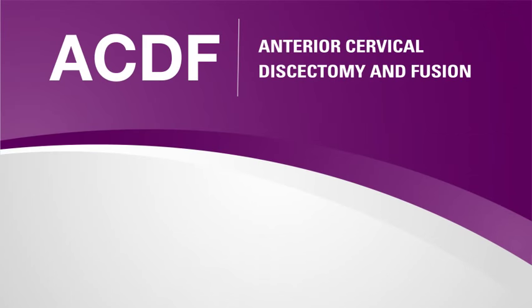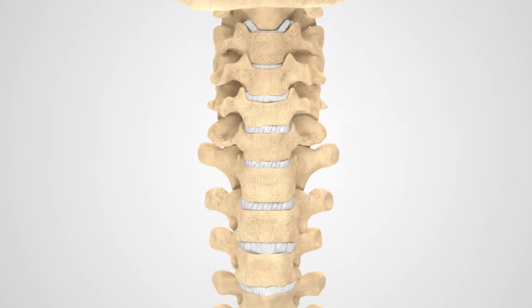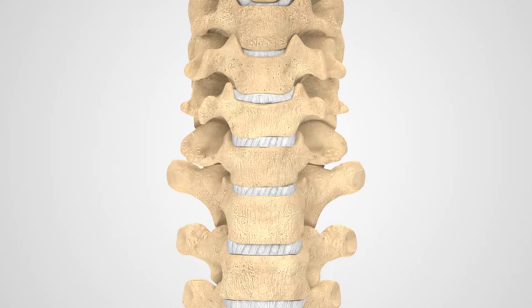An anterior cervical discectomy fusion procedure, or ACDF, is a type of spine surgery from the front, or anterior part of the neck, where your cervical spine is located.